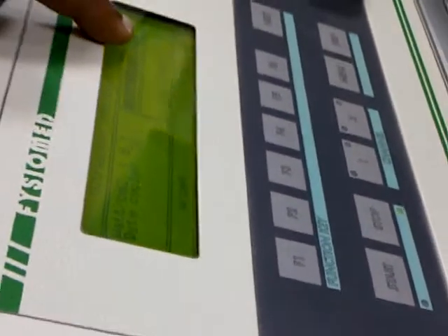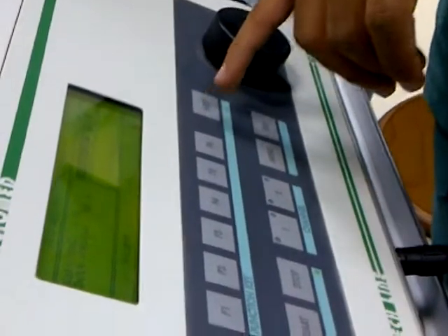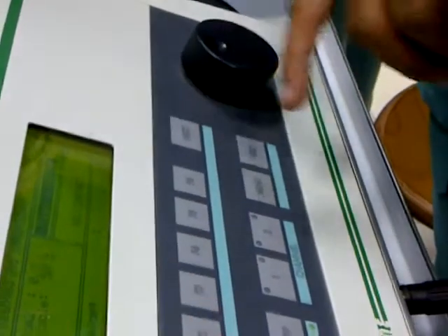Right, then start. No contact, I have to put gel. So no contact. You have gel and ultrasonic gel. Also the machine is not on, so no contact. Leave it, no problem now. But what do you do now? Apply some gel. What next? Nothing next, you have to start. But don't start now. Why?